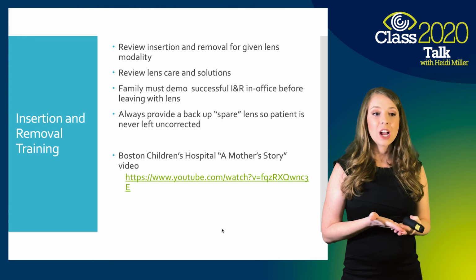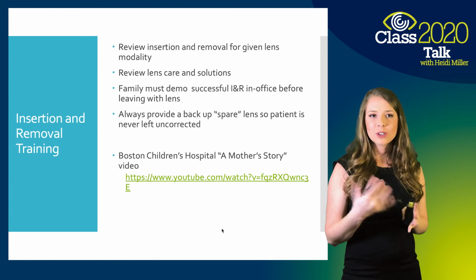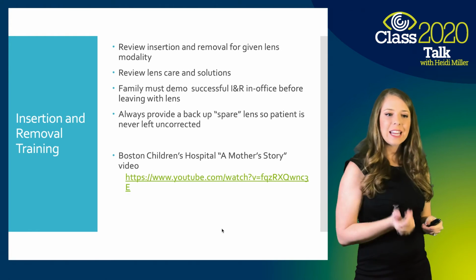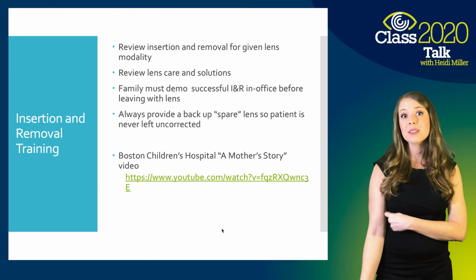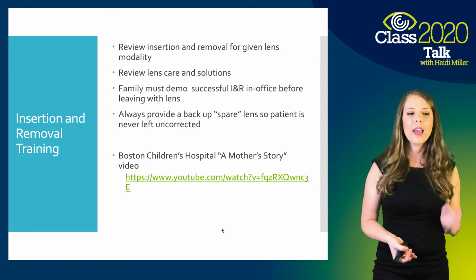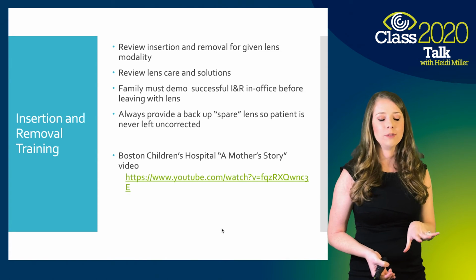The mother had multiple children with aphakia, and so she created this video, and Boston Children's Hospital has it posted, and I think it's a really good video. So feel free to take down this video if you do ever want to give something to your patients to be able to reference, so they're not just Googling whatever on the internet, they're actually seeing something that's at least safe methods on insertion and removal.